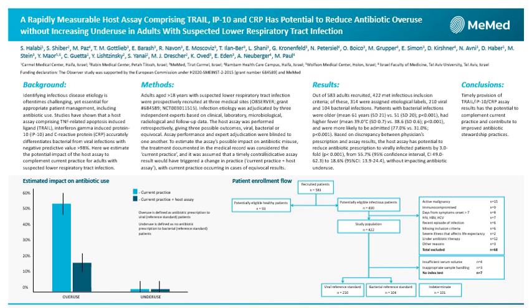And in this study, the Observer study, and in the data that I'm presenting to you now, we estimate the potential impact of this host assay to complement current practice for adults with suspected lower respiratory tract infection.